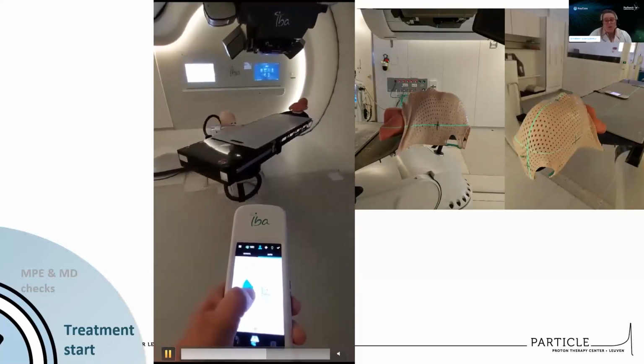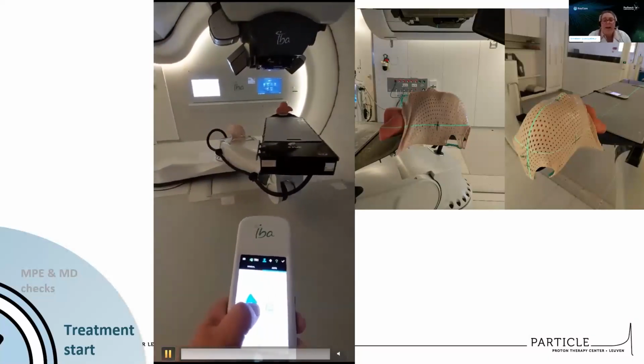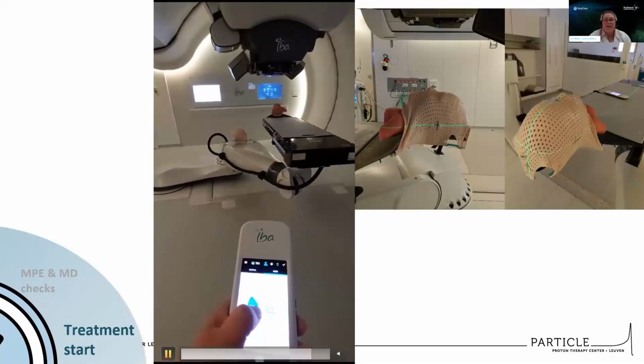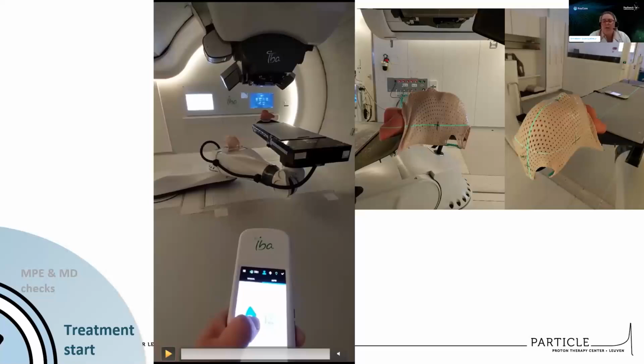So this movement is going really smooth, in my opinion, since it's going to this previously calculated and entered couch coordinates. So if the IBA system does not receive such setup position coordinates, and our RTTs need to manually move to this laser position, I can assure you that movement is not as smooth. When manually moving our couch, the couch movement is more of a 1 axis per time movement, so really a robotic type of movement. So we definitely gain efficiency here in this step, and we've received good feedback from our RTT team, and that brings me joy.